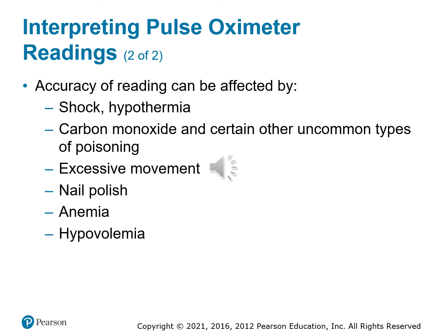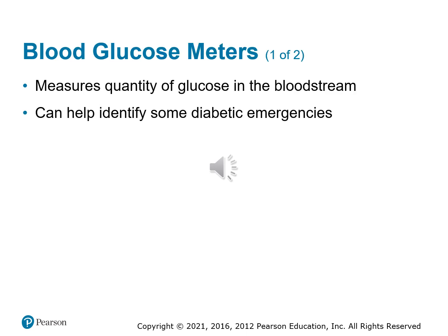And it's not unheard of that happens. Try to adjust. When it fails, though, look at your patient. You can always do the visual check. If they're pink, warm, and dry, and they're not in respiratory distress, don't put a ton of stock in an abnormally low or no reading at all on the pulse ox. It just really depends on some variables.